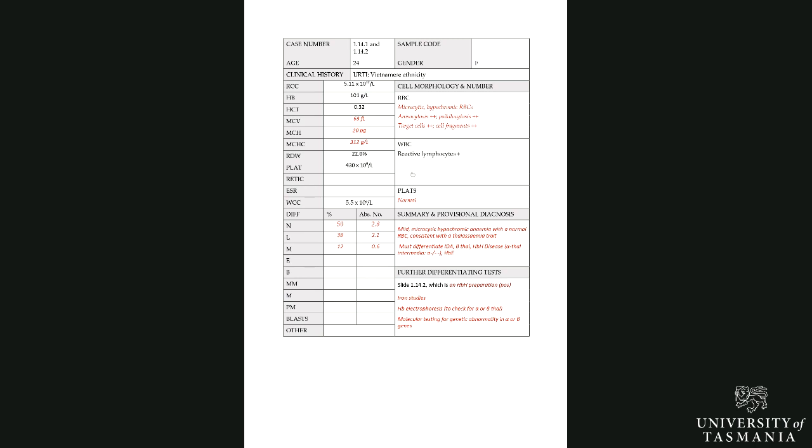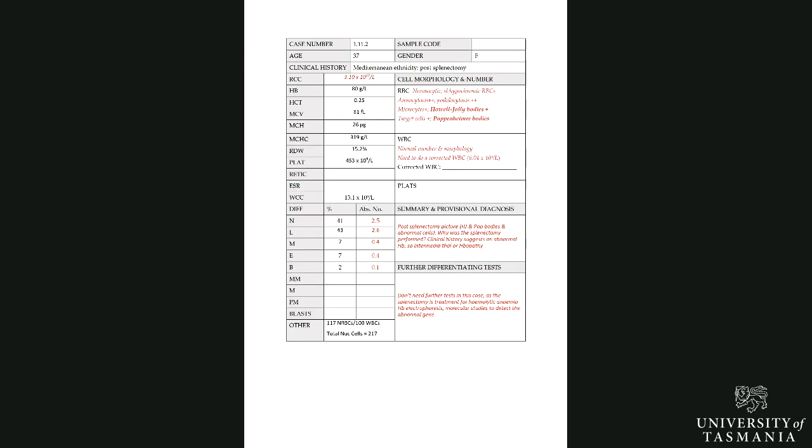And so they are the tests that you would do along with the hemoglobin H preparation to check for alpha thalassemia. And you could also do things like HPLC or isoelectric focusing to semi-quantitate the hemoglobin A2. So has anybody got any questions about that case study?